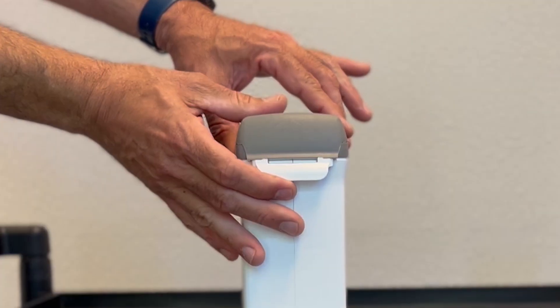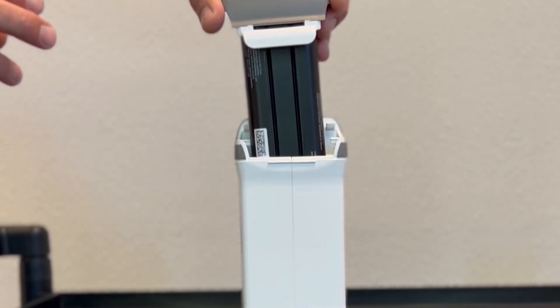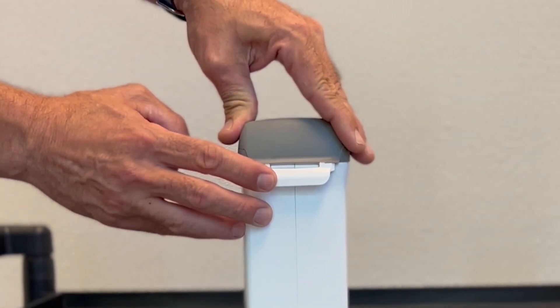To remove the battery, pull up on the flap and pull the battery out. To reinstall the battery, slide it back in and secure the flap.